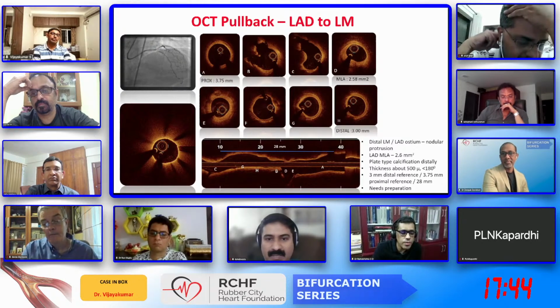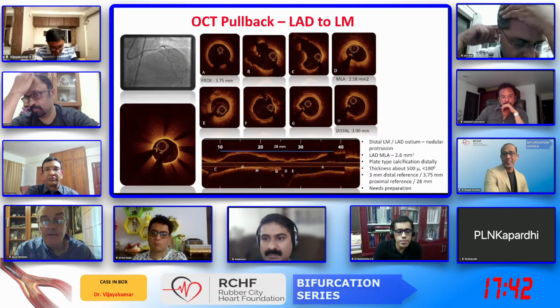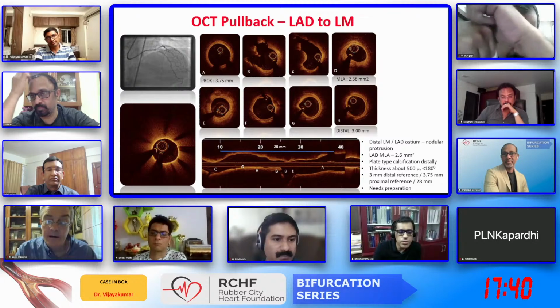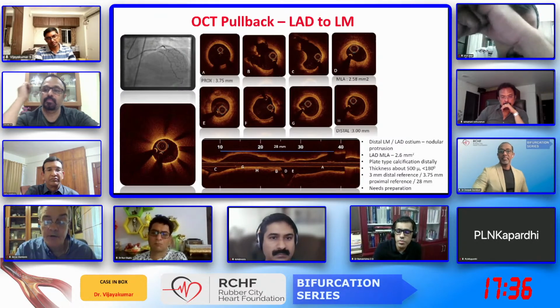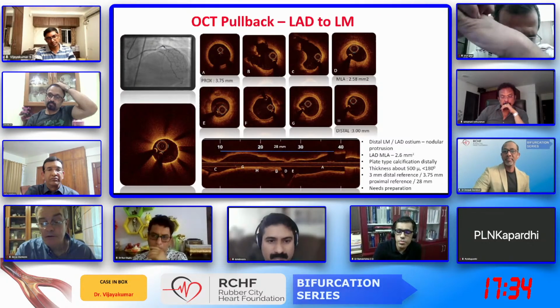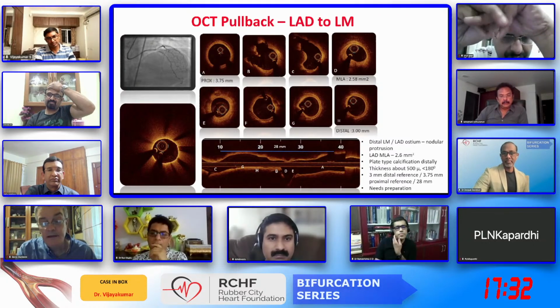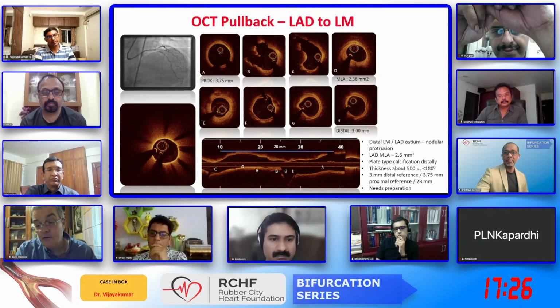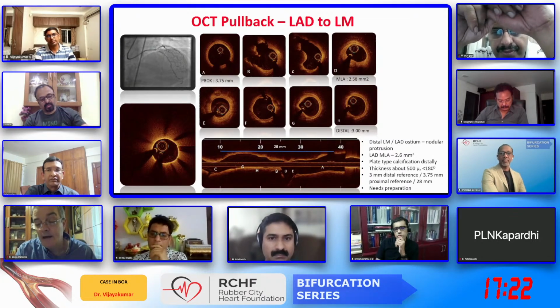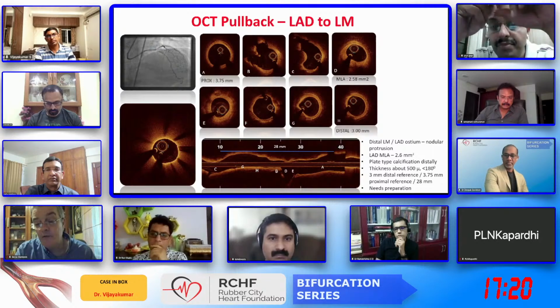What is his strategy? We have both rota and IVL, and it's usually rota to crack and then an NC balloon because of the cost. And if it's really deep calcium or nodular, we prefer to use IVL, although results are not superb, at least from anecdotal cases, this is what we learn from others.